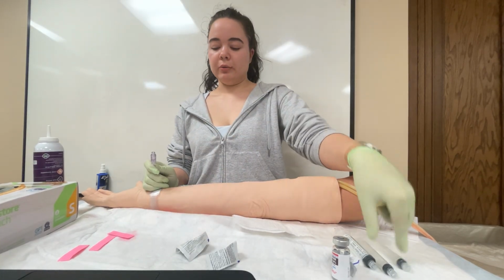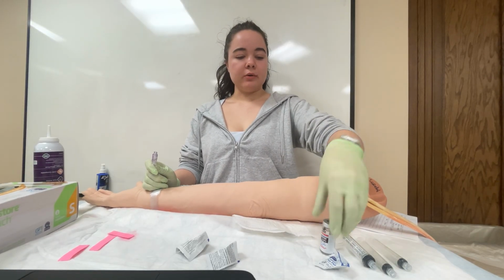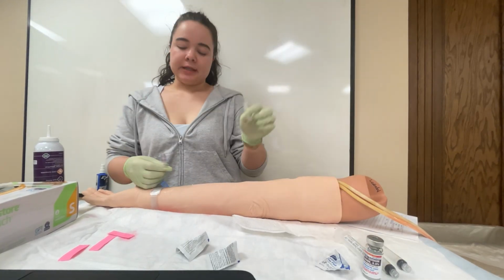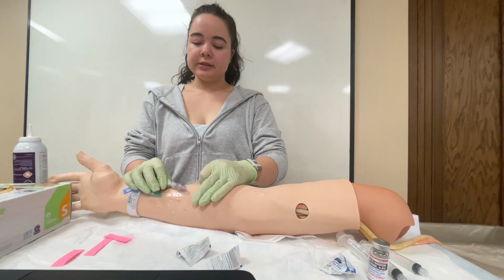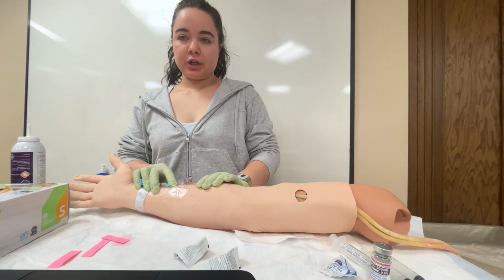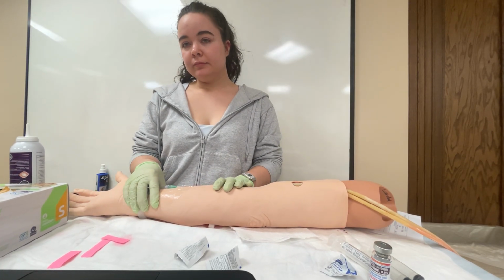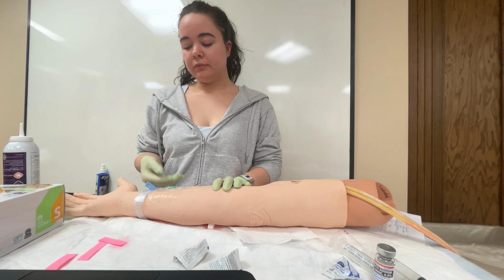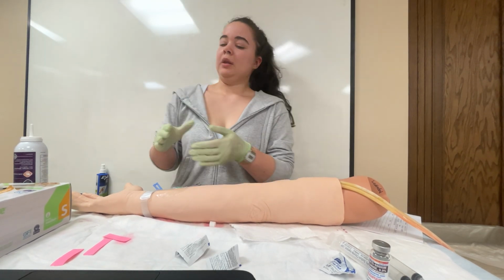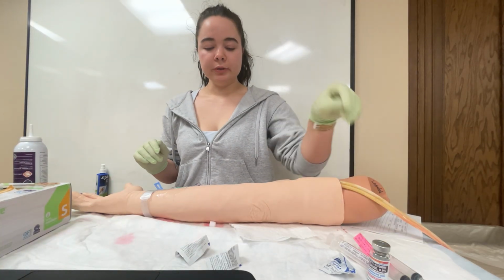I want to dispose of all my medications in the proper receptacle. So my 3 syringes over here and my med right here. I'm gonna go ahead and take some tape and just properly secure my J-loop. And then again, I would note for any infiltration and inflammation immediately after giving anything through my IV, and none were noted. Like I said, the labeling did fall off, but my medication was labeled.